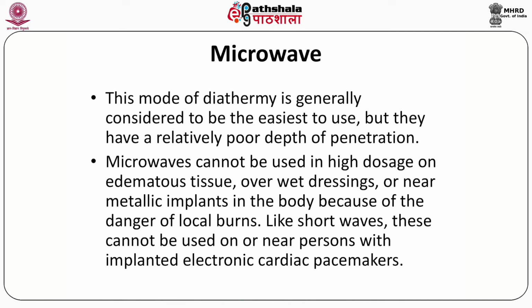Microwaves cannot be used in high doses on edematous tissues, as with the shortwaves, over wet dressings or near metallic implants in the body, because of the danger of local burns. Like shortwaves, these cannot be used on or near persons with implanted electronic cardiac pacemakers. So more or less, the contraindications are the same in the shortwave and microwave.